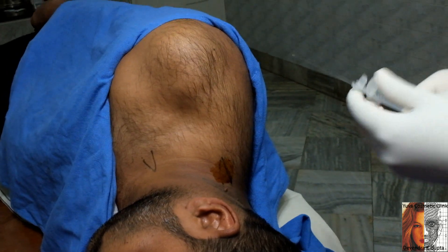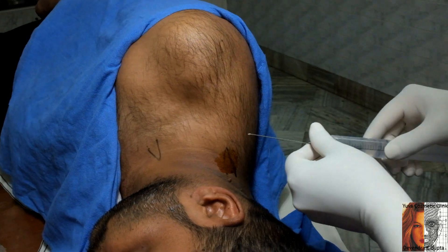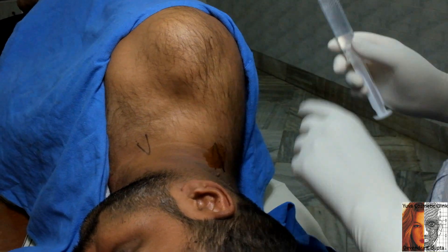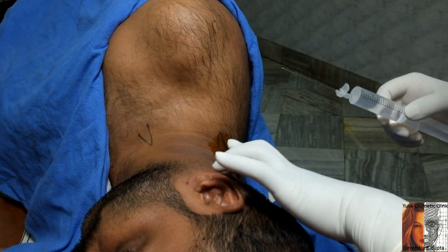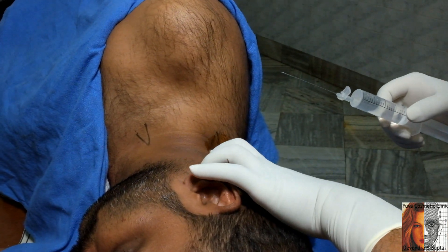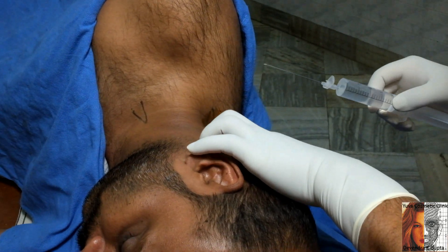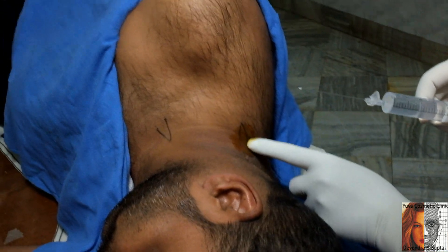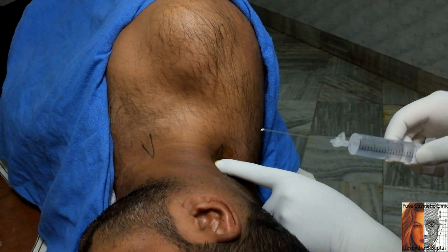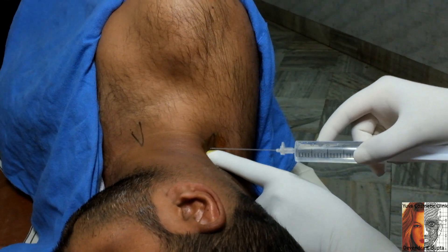Just put the tip of the index finger in the cleft between the levator scapulae and the trapezius here. The tip of my index finger is pushing the levator scapulae anteriorly, and here I am inserting the needle.